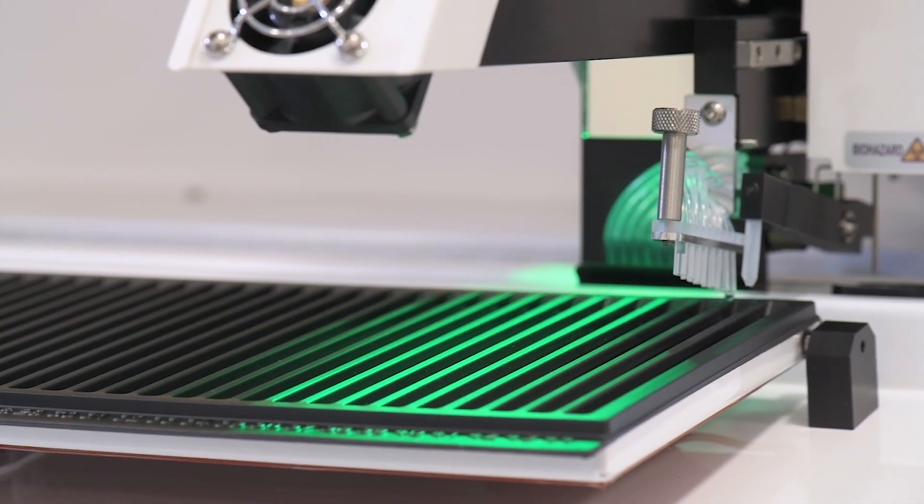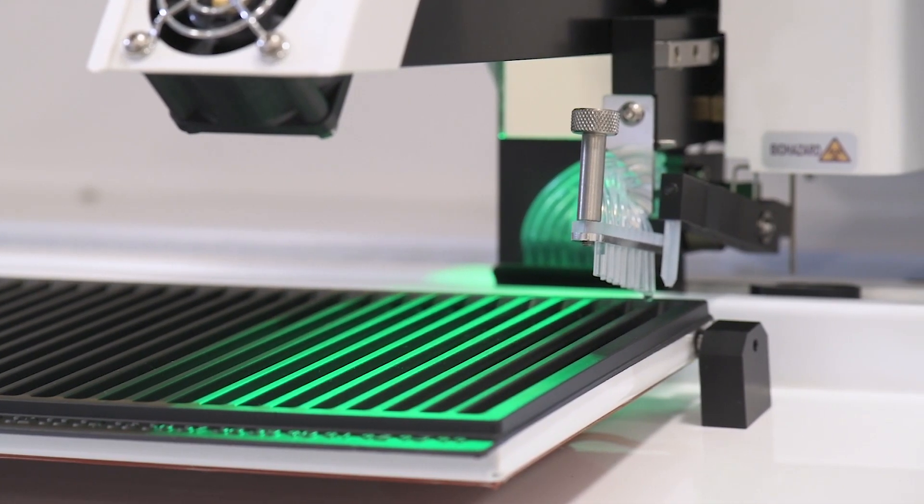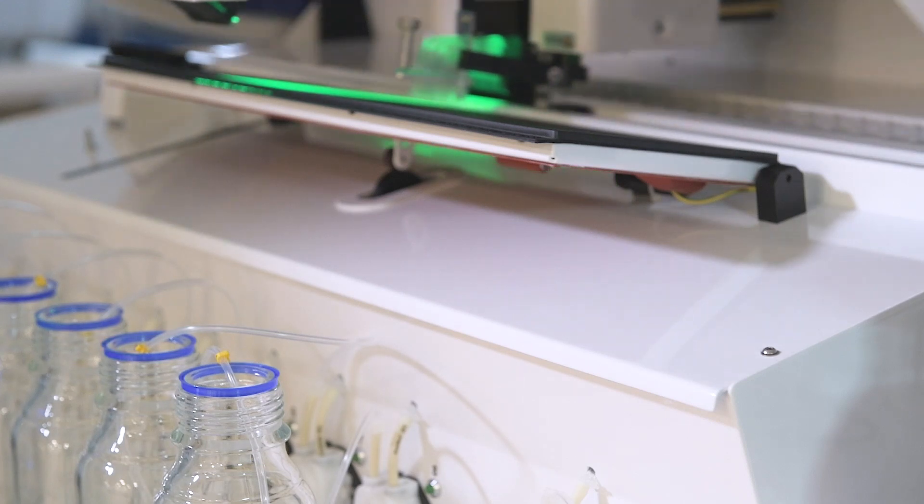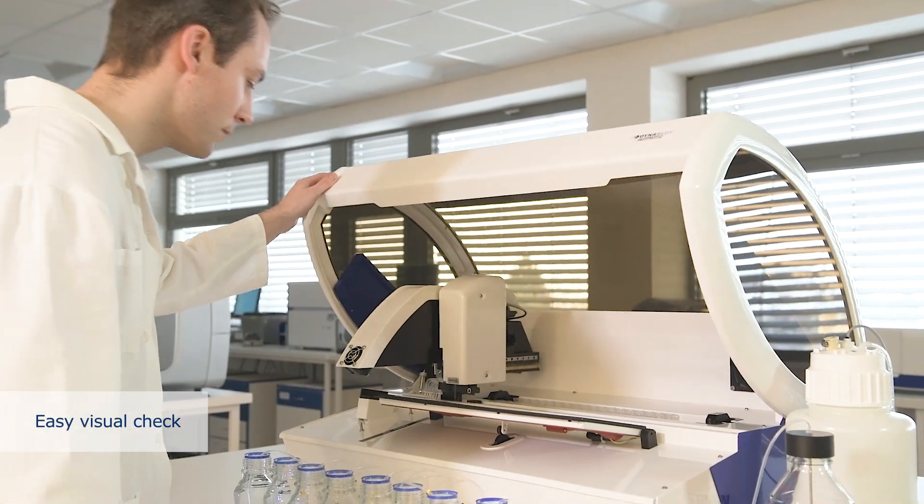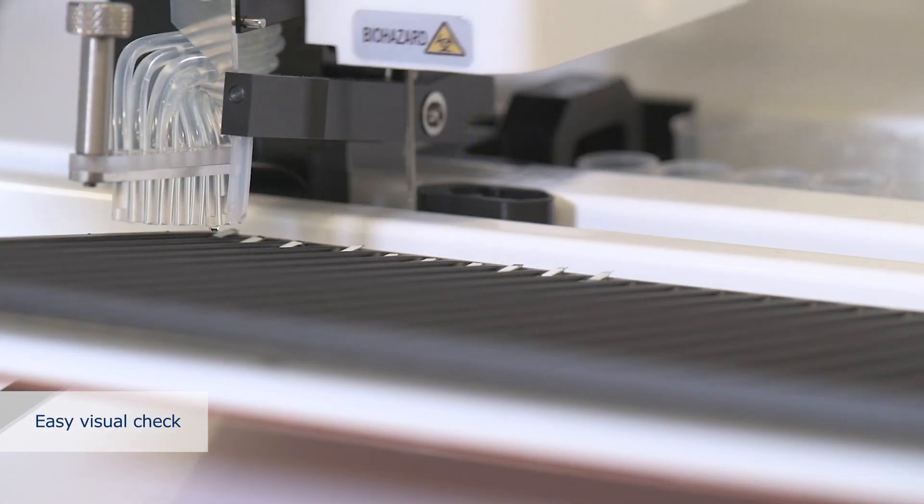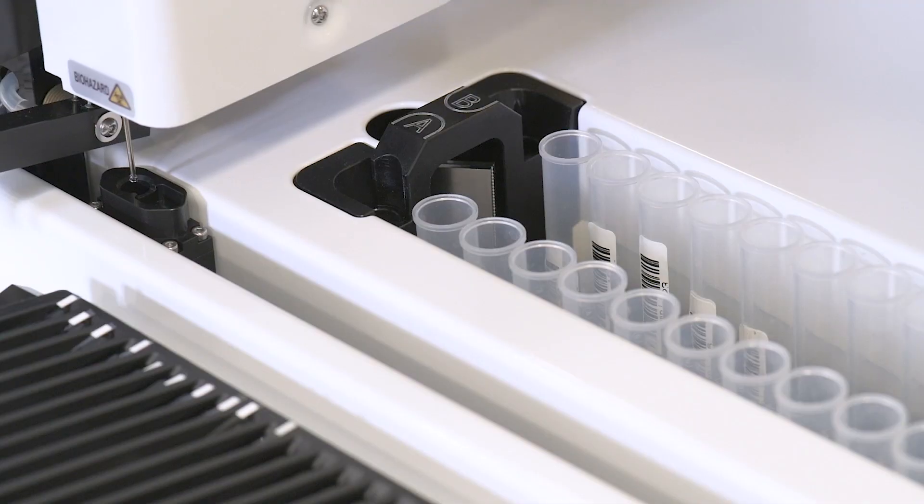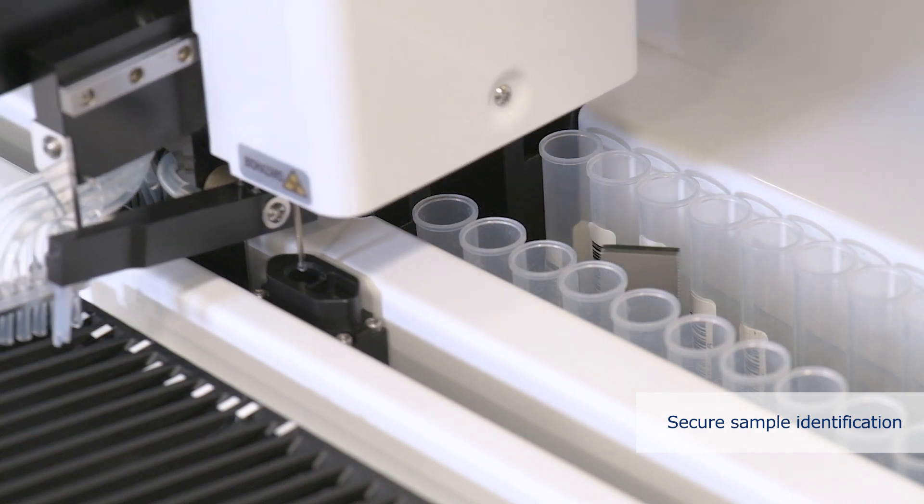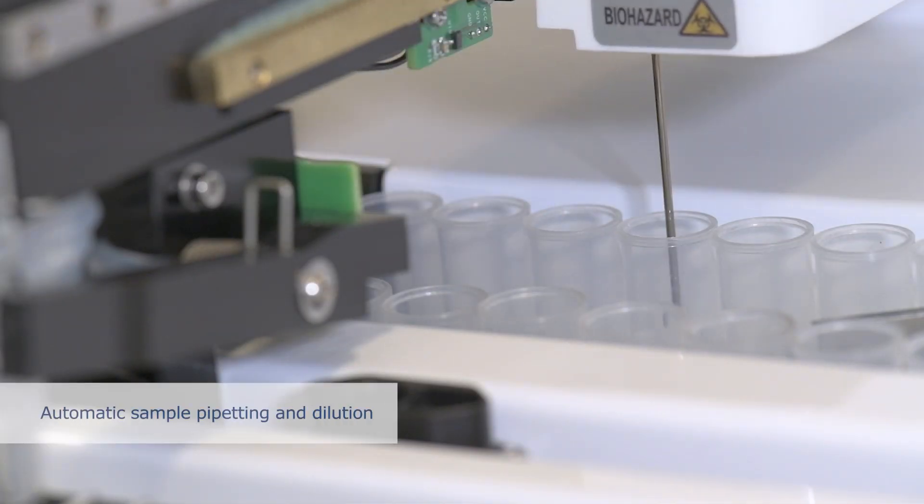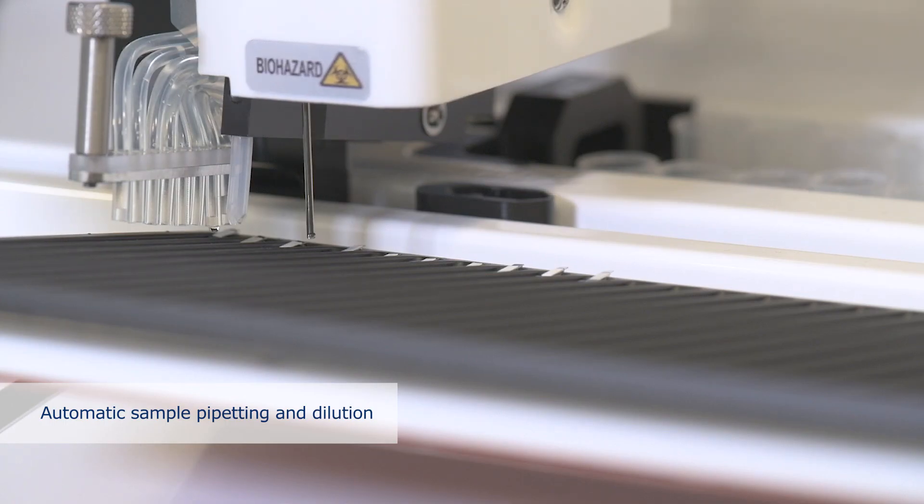DynaBlot Automatic then performs all downstream steps automatically without any input from the operator. The smart layout allows easy access and a visual check of the process. Sample tubes can be identified by an integrated barcode reader. The washable pipetting needle is able to sense the level of samples and dilutes them directly in the tray.